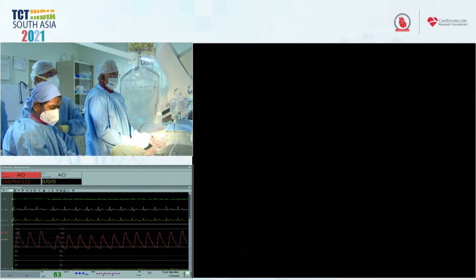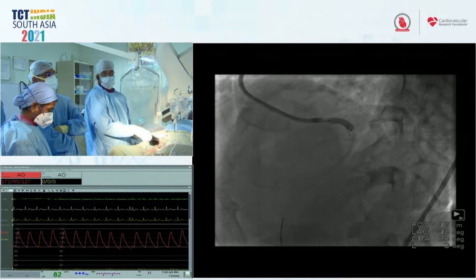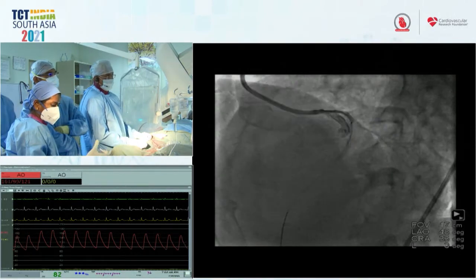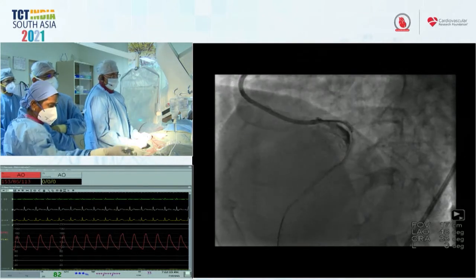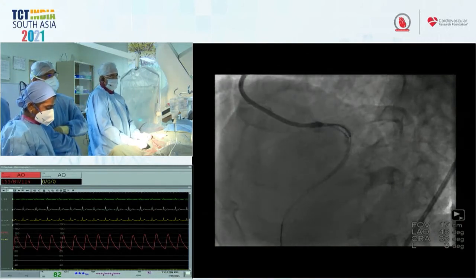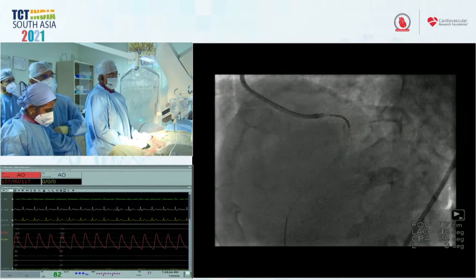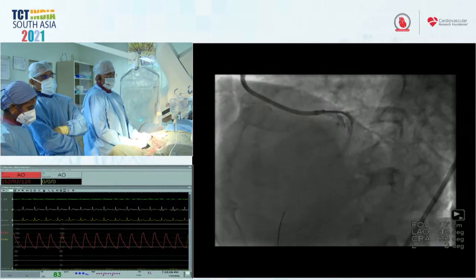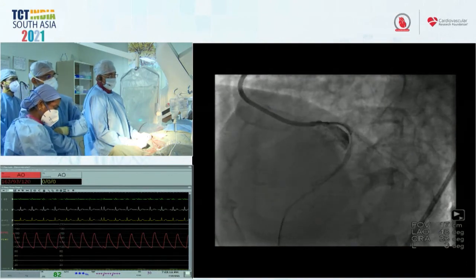The length was a couple of millimeters extra, just as we expected, the 18 would be a little long. So that's placed a few millimeters outside the ostium of the left main, and just across into the circ. We had this issue that we discussed, and Ziad said that we may have to cross into the circ when we get this 18 millimeter stent. So we had a few millimeters into the LAD across the circ. So it was 18, not 15? It was an 18, yeah. Okay, next shot, please.